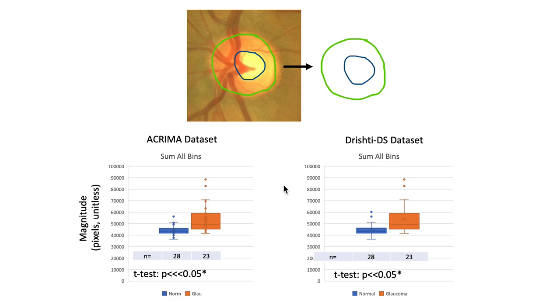So far, we found about 5 that are great for developing a machine learning model. And given how well the scatter separates from each other, we're confident that we'll be able to develop a machine learning model that classifies glaucoma with at least 90% accuracy. And we will move forward in doing that.